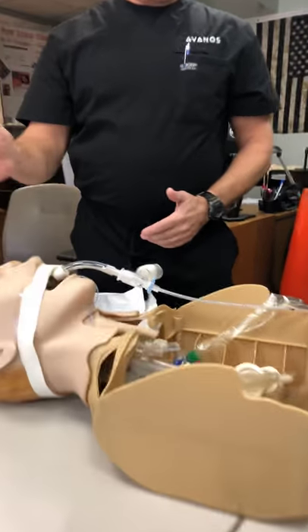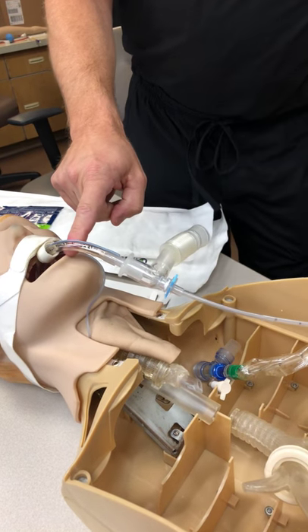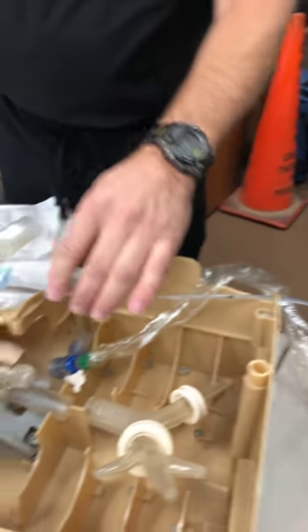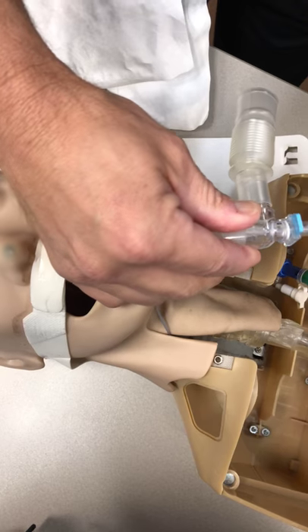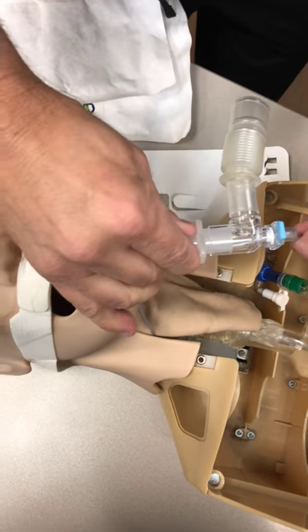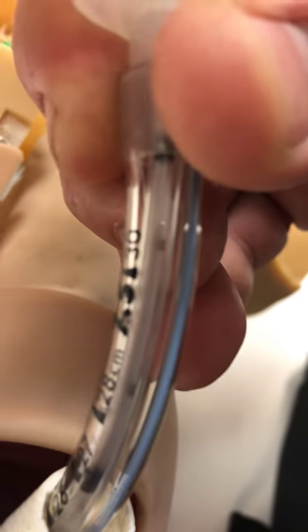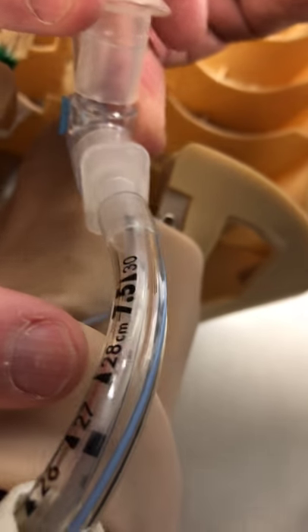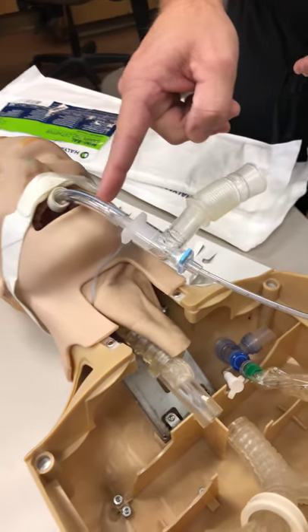Now we're set up. Next thing we want to do is advance until we get our mini-BAL to the very end of our endotracheal tube. To do that, we're going to match up the last number on our ET tube with the corresponding number on our mini-BAL, and we would just go ahead and advance that until we get to the end of the ET tube. The numbers on this smaller catheter — for a 6.5 or smaller — are going to be a little bit harder to see, so I like to look at the number before I go ahead and insert it. That way I can know how far to advance it.